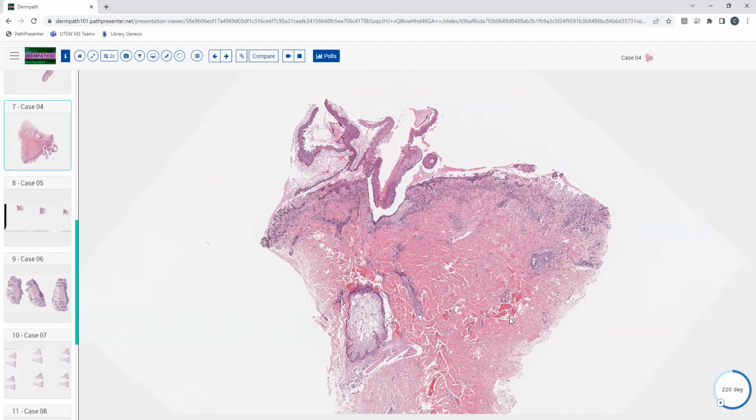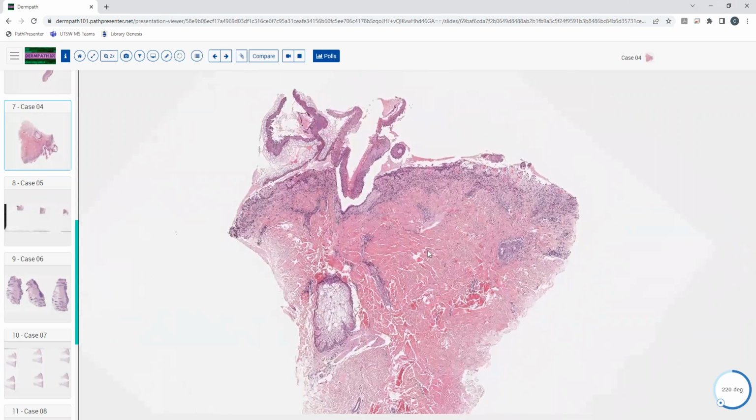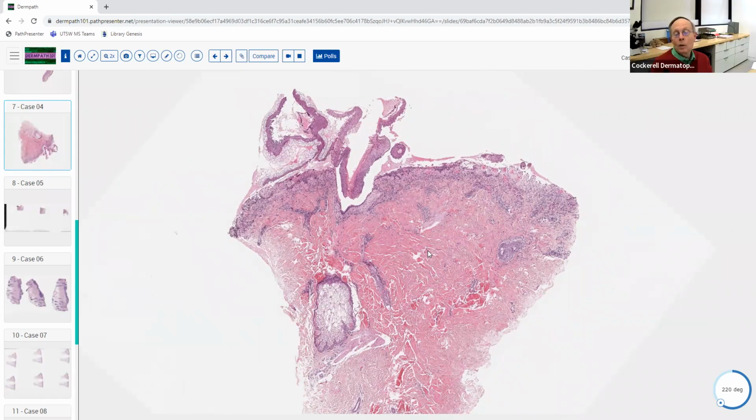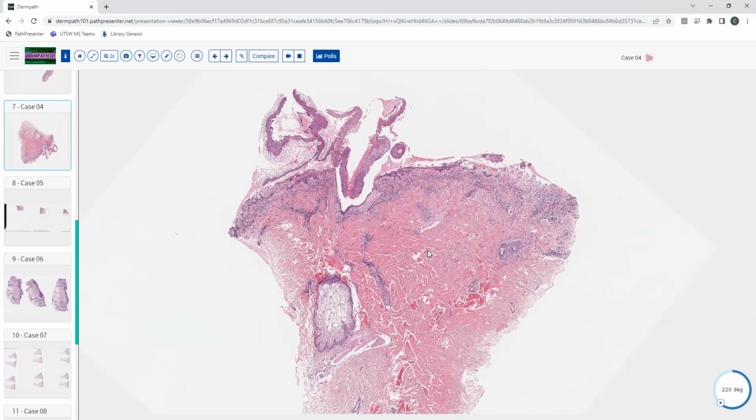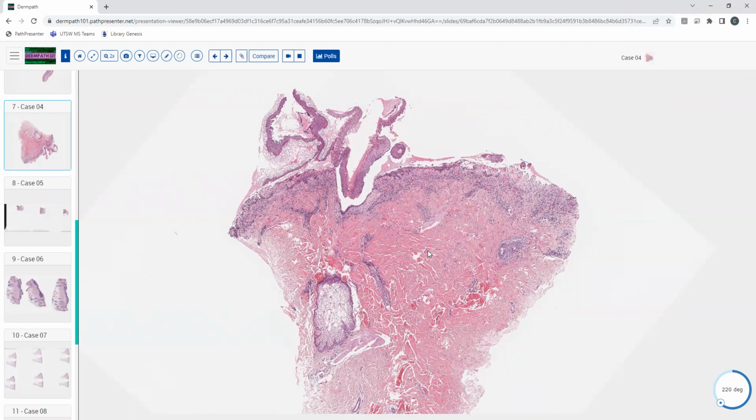So it looks like, yeah, in the epidermis, we're obviously getting a split. And it looks like it's from this part just superior to the basal layer. So your pattern then is going to be what? Thinking of bullous disorders. Okay. And so when we think about blistering disorders, there's 4 different mechanisms, but 3 primary mechanisms for getting a blister.